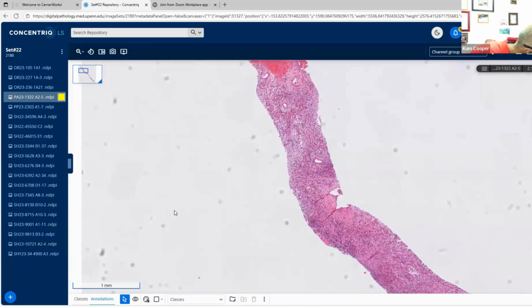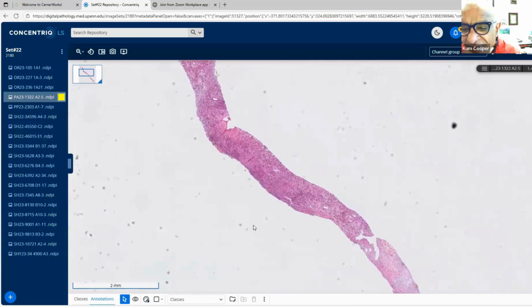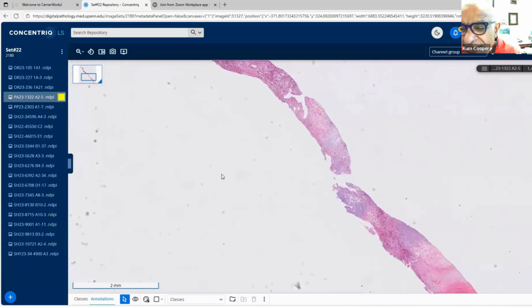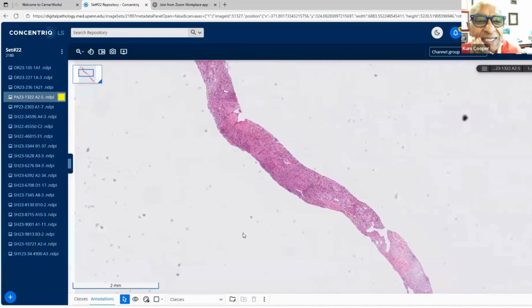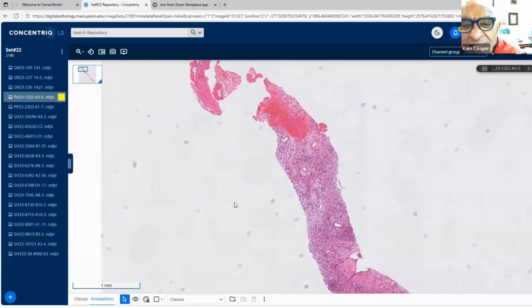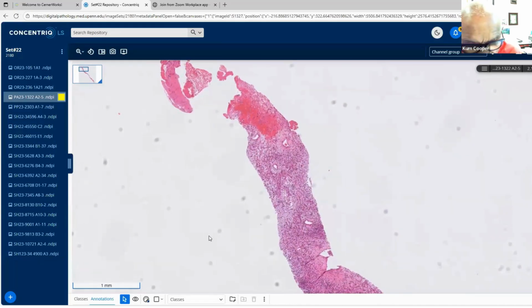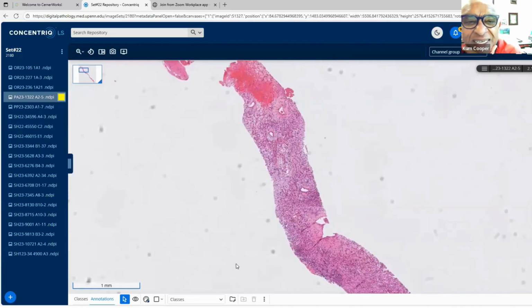This is a 54-year-old male. This came from one of our sister hospitals. We have 3 hospitals in the city in Philadelphia, and this came from one of them. This was in the sinus fat of the kidney. It was called a kidney biopsy, but it was actually in the sinus part of the kidney. I don't know how they got to it, but anyway, when you go into the radiology, this was actually from the sinus fat area.